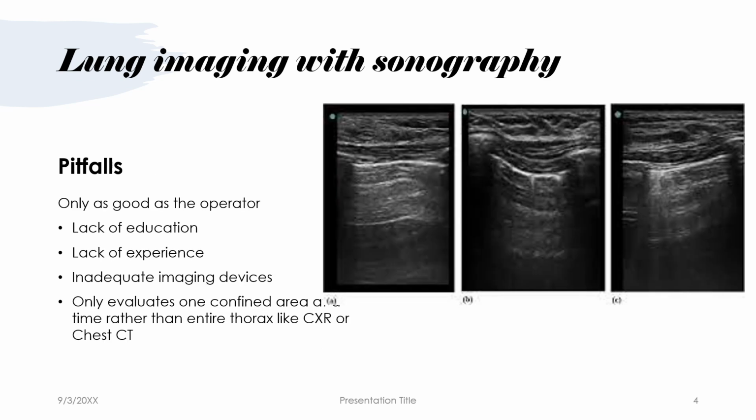So some of the pitfalls, however, with lung imaging is we know with anything with ultrasound, it's only as good as the sonographer. And then to take that one step further, the sonographer can sometimes only be as good as both their training and the equipment that they have. And we know as lung ultrasound is relatively new, and some of us like me were very skeptical, the use of it out in the field has been somewhat limited.